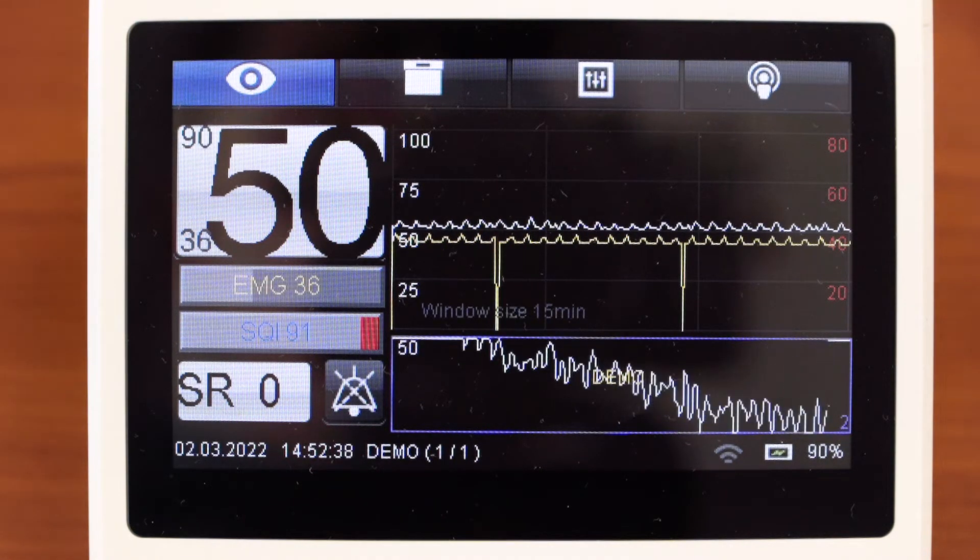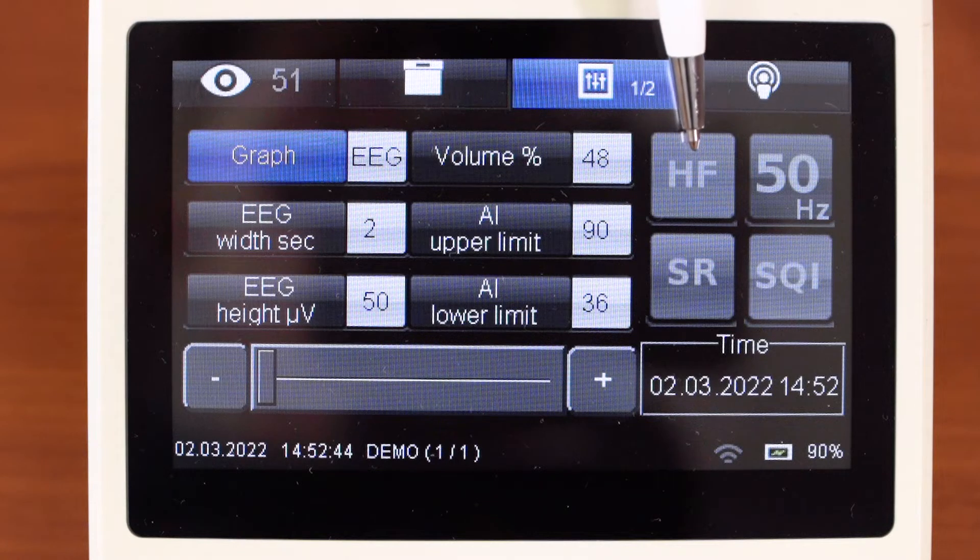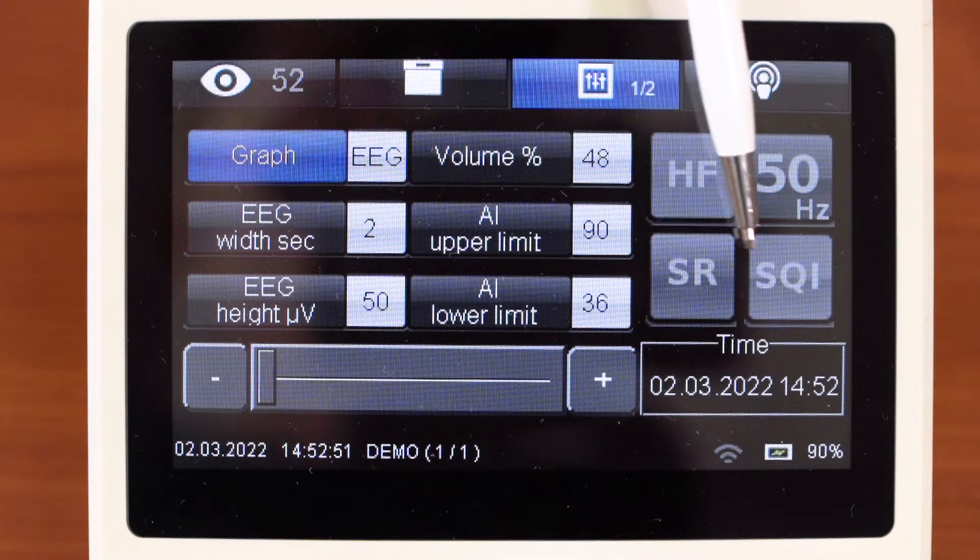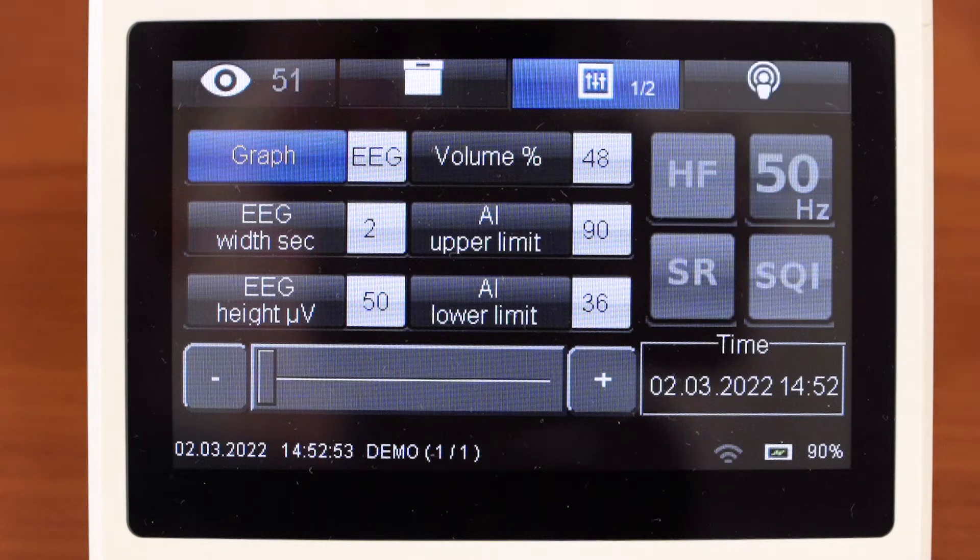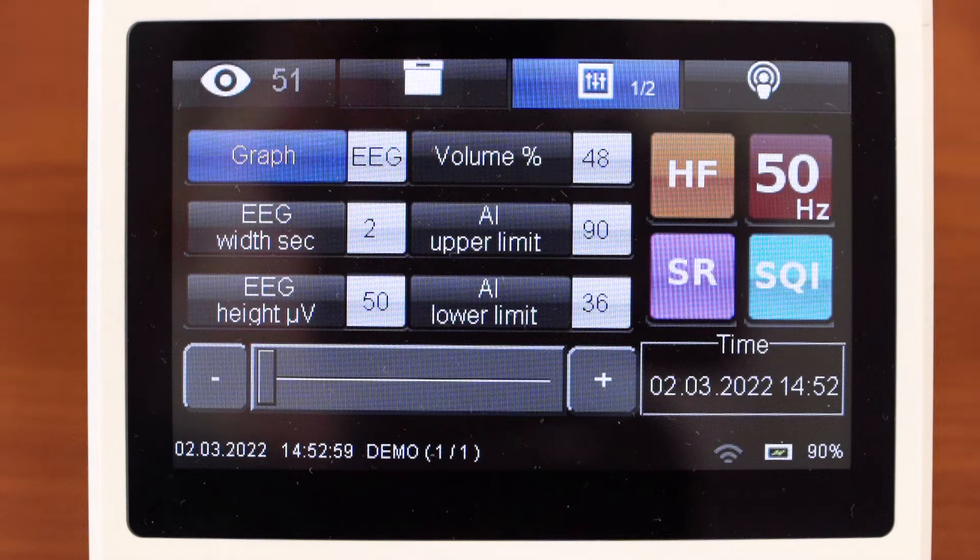Open the window settings. There are high frequency noise, power line disturbances, suppression rate, and signal quality index. To add graphs just press these buttons. You will see additional graphs in monitoring window.